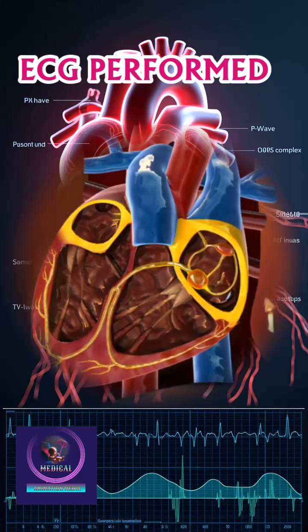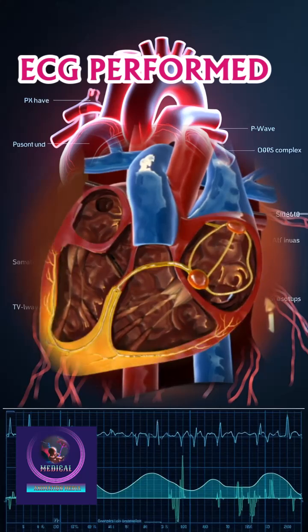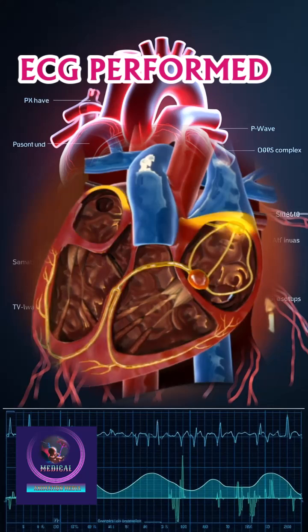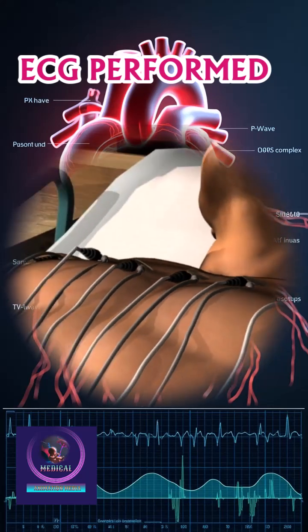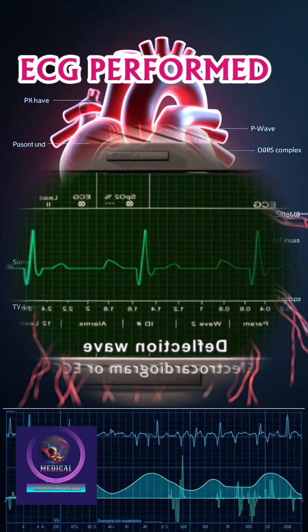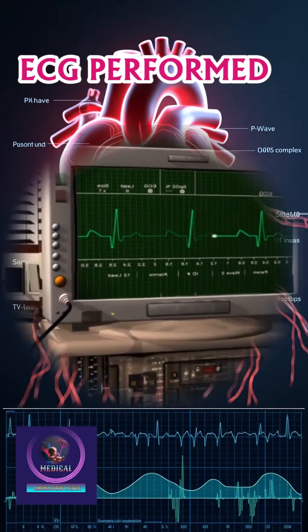As this impulse moves, it generates electrical currents that spread throughout the heart. These electrical currents can be detected, amplified, and displayed as waves. This recording is known as an electrocardiogram, or ECG.